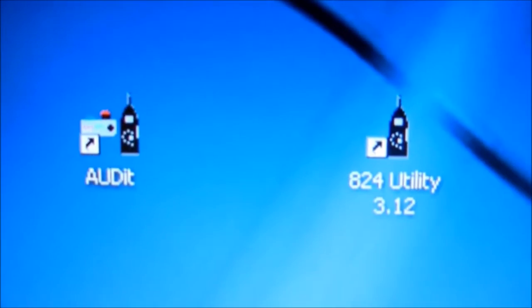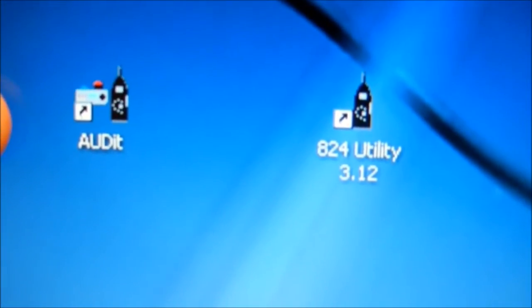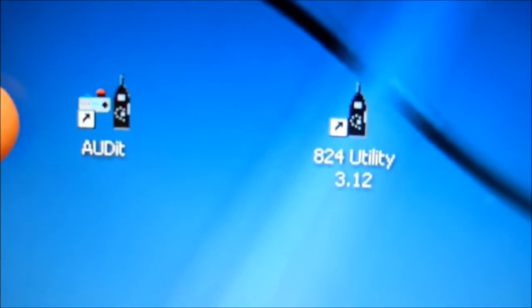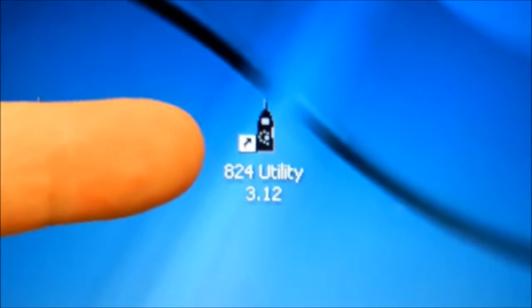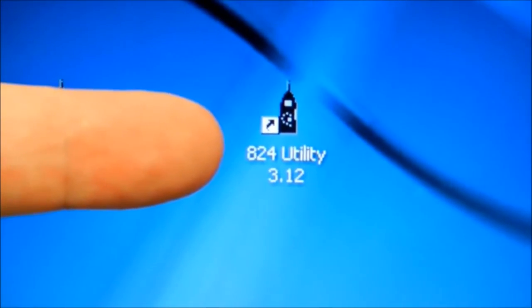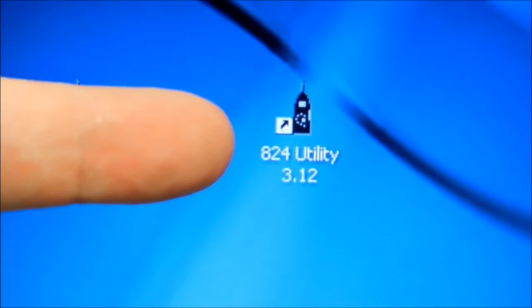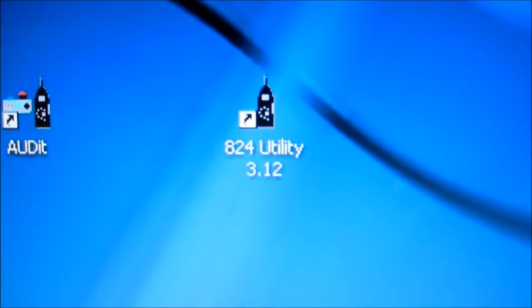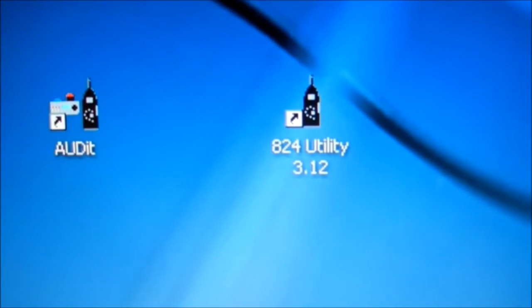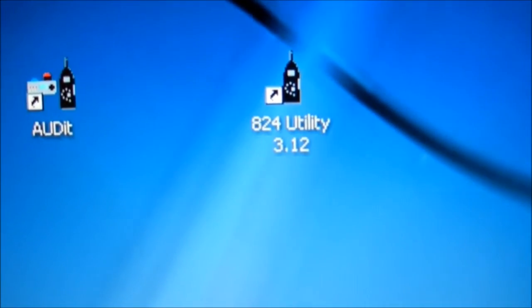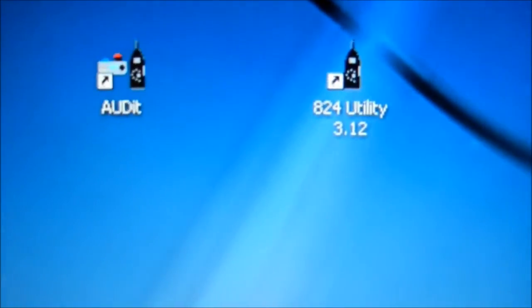Here's a screenshot of the audit software that we will use as an interface to calibrate the audiometers, and this is the 824 utility for the sound level meter where we can change information such as ownership, name and address.